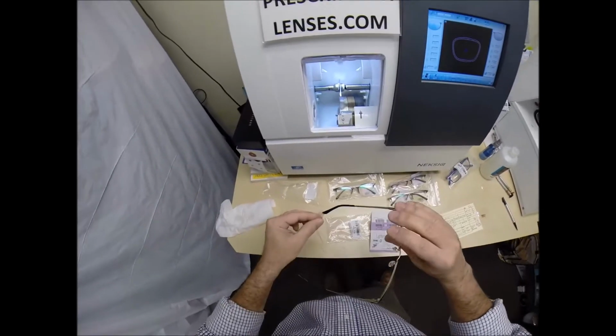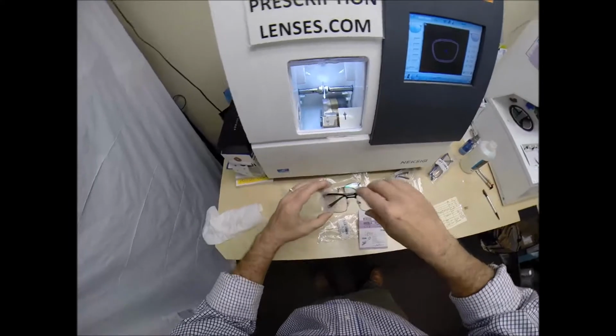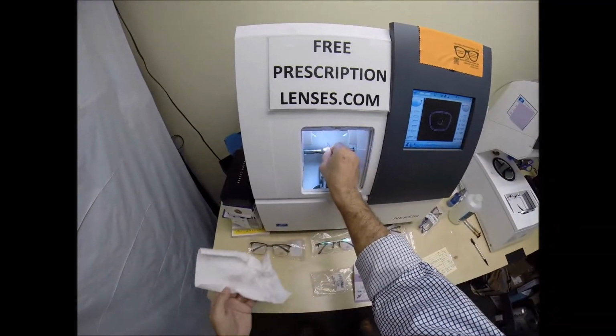Let me slip this back on there. We're going to get through them all. Let me take that left lens out.